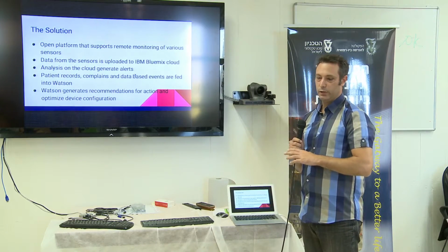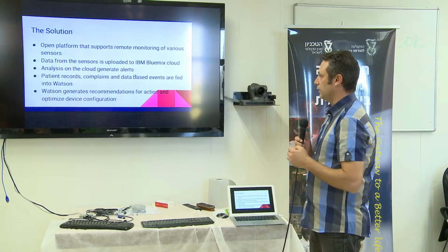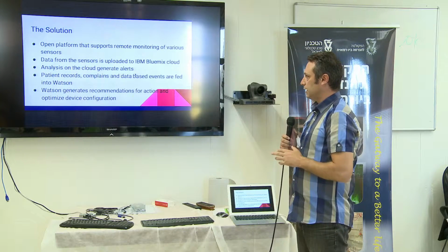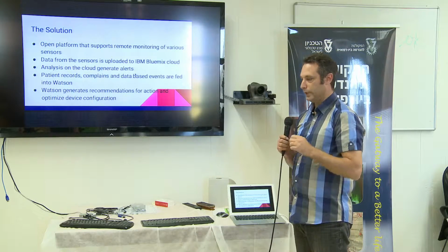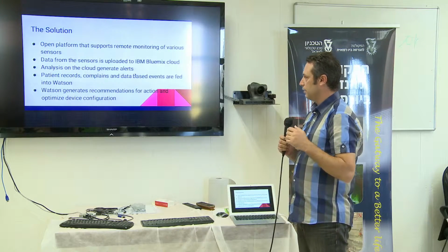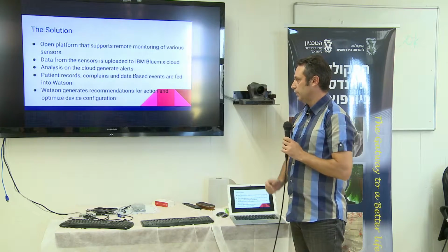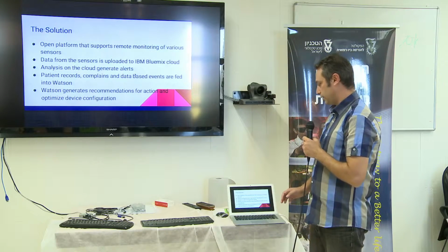So basically, we took various kinds of sensors, connected them remotely to the cloud, and we allow each sensor to upload the data to the IBM Bluemix cloud, where we wrote some algorithms to analyze the data and generate alerts that go back to the patient or to the caregiver or the doctor, giving some data based on the alerts. All the patient records, his specific complaints, and the data that we generate are fed into Watson, and Watson generates recommendations for action and optimizes the device configuration.